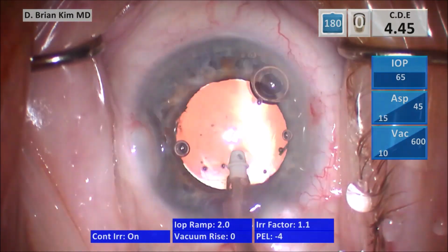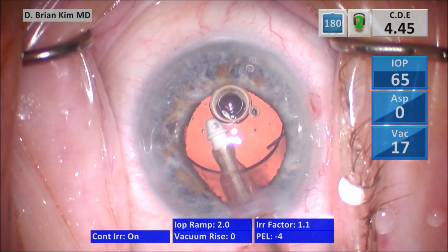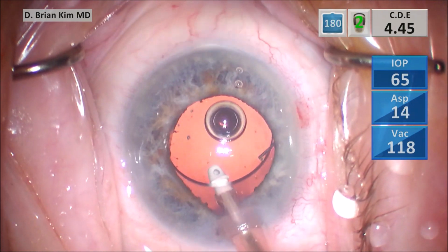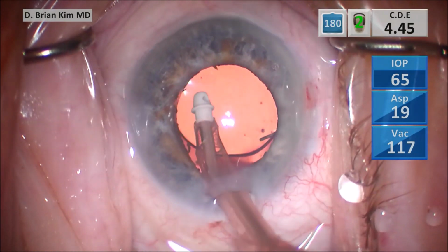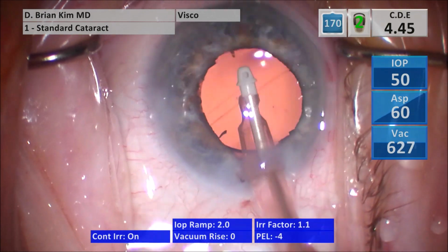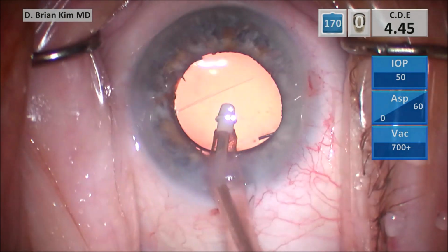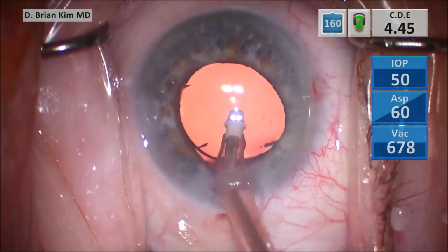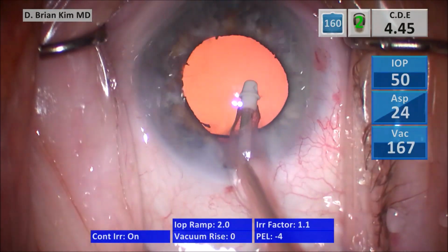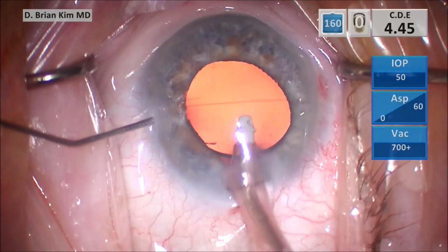So I go in with irrigation off, activate irrigation, remove the viscoelastic from within the bag. And the whole time I'm watching my incision, making sure the iris doesn't prolapse out here. I'll switch to visco mode, removing all the viscoelastic from the anterior chamber. Again, being very careful and mindful of iris prolapse here at this point, since I don't have that iris hook there anymore. And then I'll hydrate my incision. So again, this is a patient with a very, very dense lens, pretty big pupil, but it did show up as IFIS with iris prolapse.